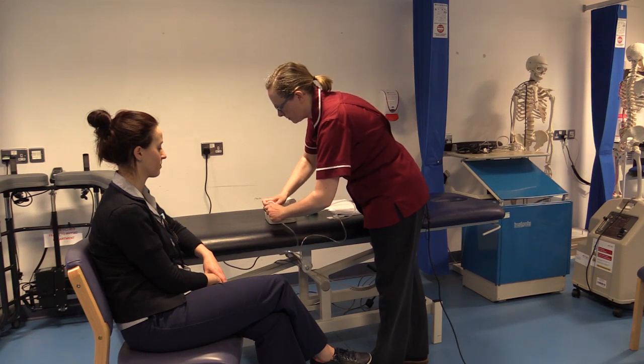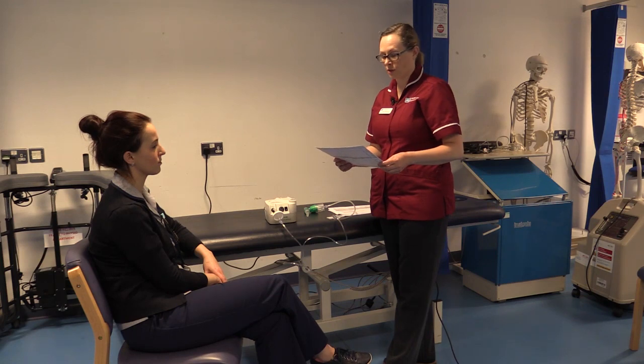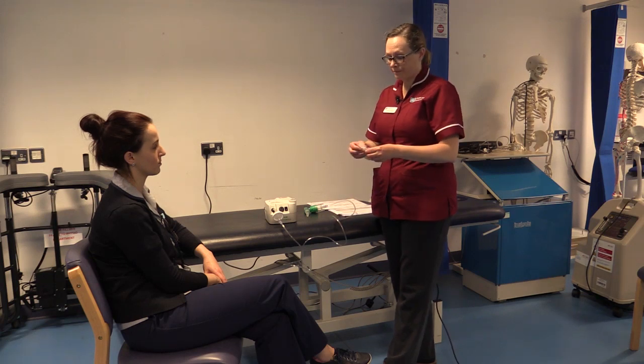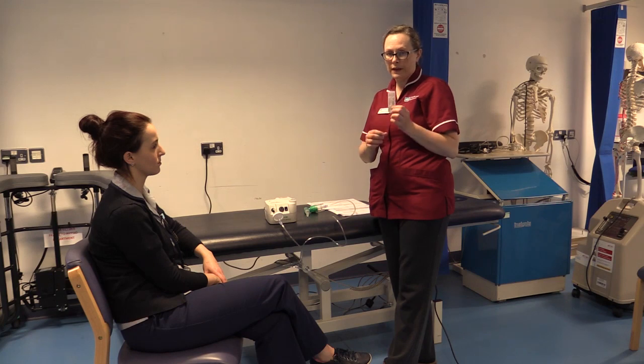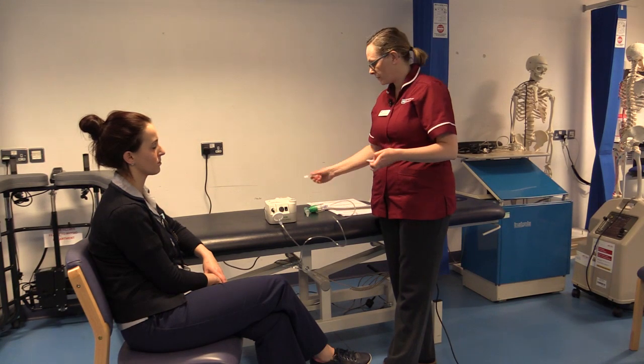But like any drug, you must ensure it is prescribed on the domiciliary care medication instruction sheet, and it will be in section 3. And one example of a drug will be salbutamol. All nebuliser drugs will come in little vials like this here, plastic vials in a box, and they can be separated easily.